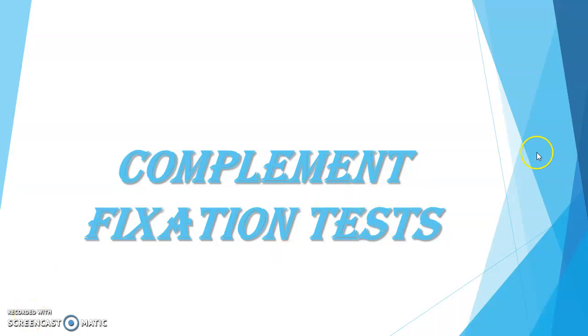Everyone, today we will learn about the complement fixation test. In general, complement fixation tests (CFT) are best performed in reference laboratories where facilities exist for the careful standardization and control of reagents which these tests require. And we will also learn how this test came into existence.